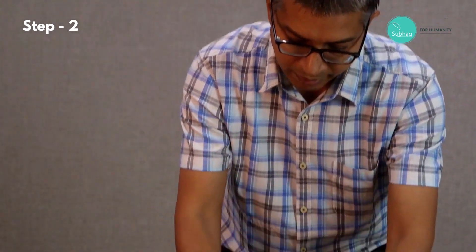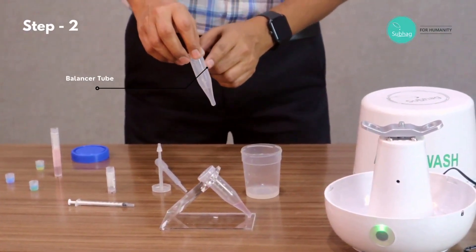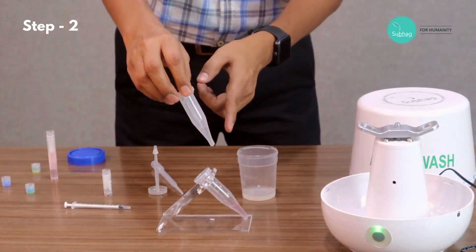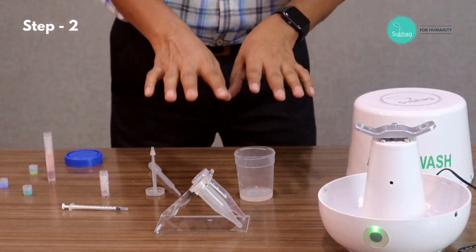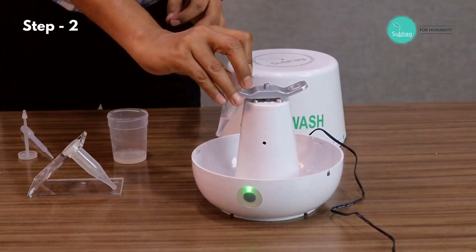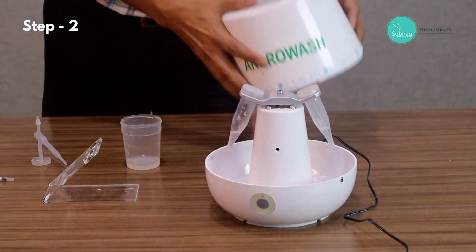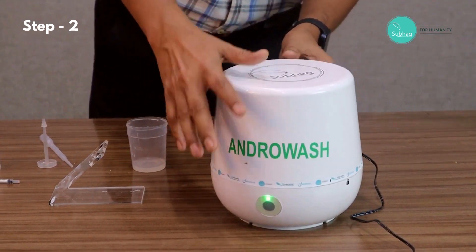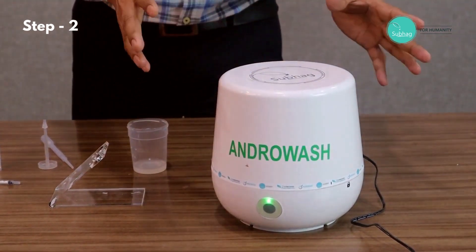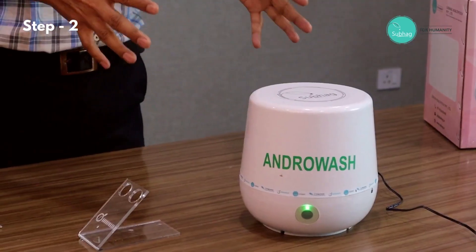Then we put the cap back and balance the water level on the balancer tube. Now it is ready for the second stage washing, so we put the tubes back into the rotor and put the cap back, align it, then lock it. Now we simply press start. The machine will run for five minutes for the second stage washing and after that it will automatically stop. The second stage washing is now complete.